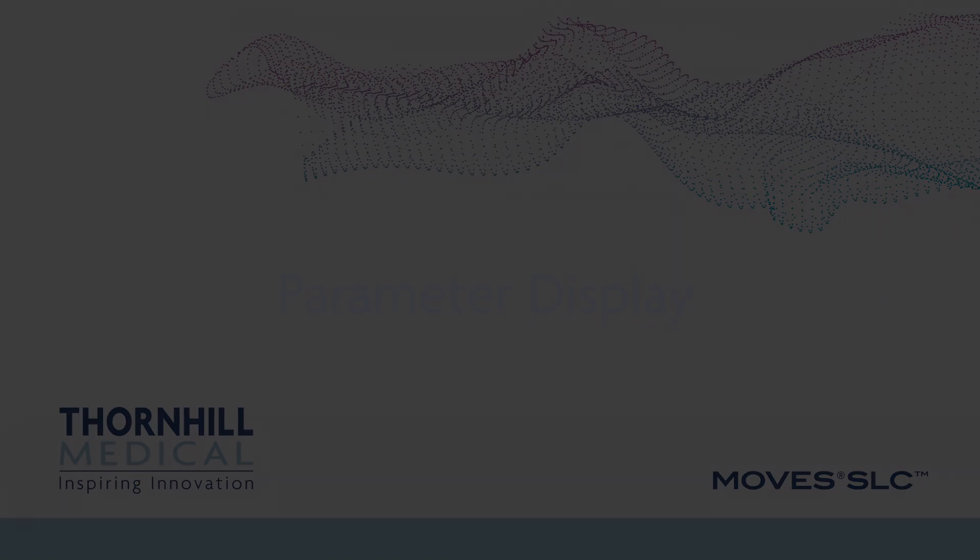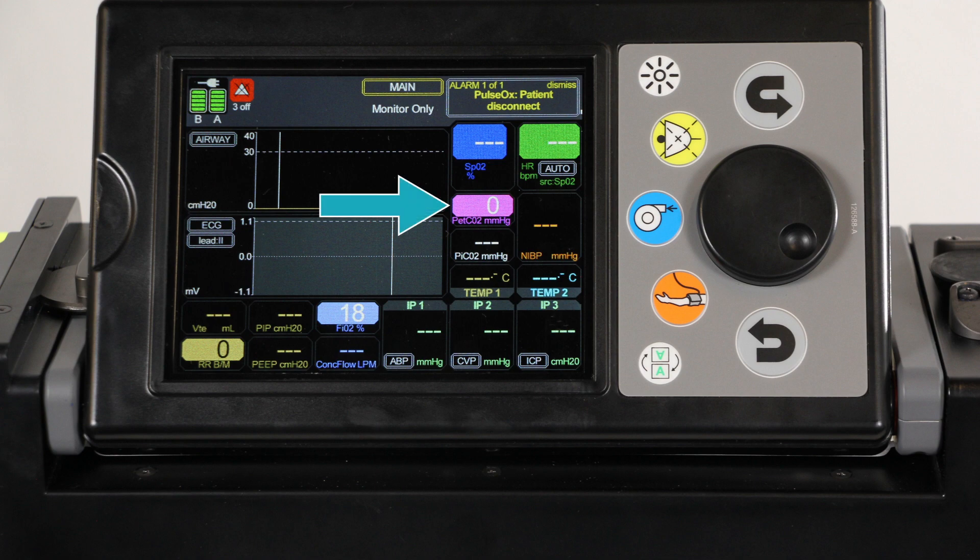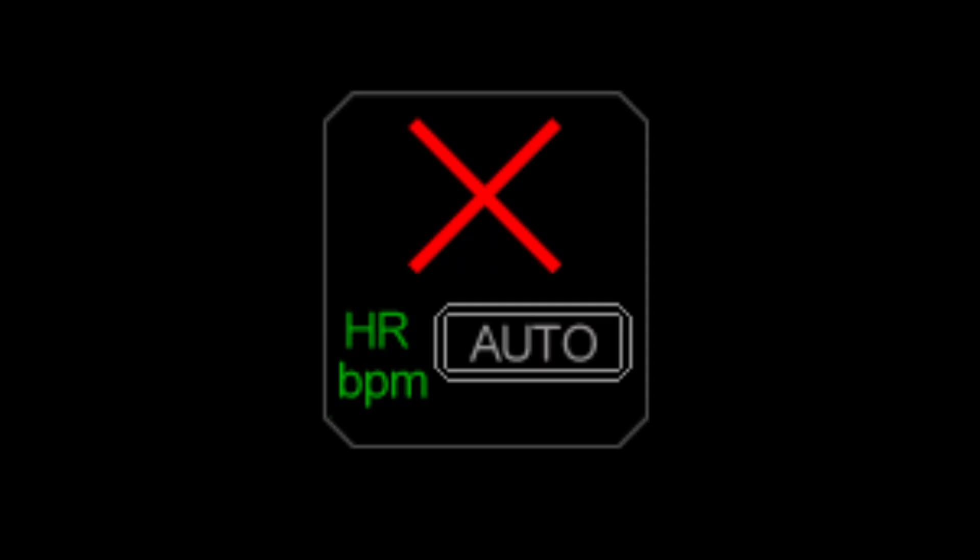Parameter display. On the main screen, parameters in the normal range will be displayed as color text on a black background. Any value that is out of normal range or has an alarm currently active will have a reverse color scheme with the background displayed in color. Any unknown numerical patient values have a default display of dashes instead of an actual value. Unknown values may relate to sensors having not been connected, improper patient connections, or out of range readings. If a fault prevents data display, the fault icon, which is an X, is displayed.